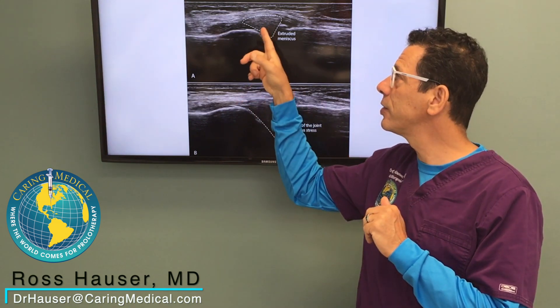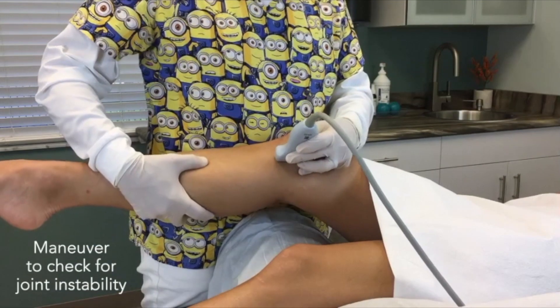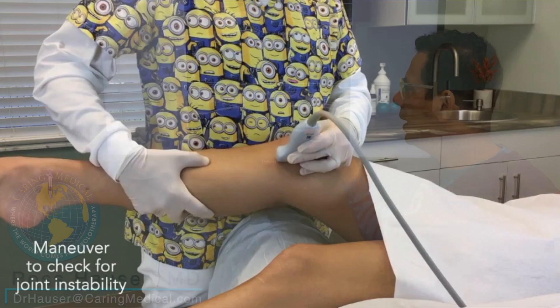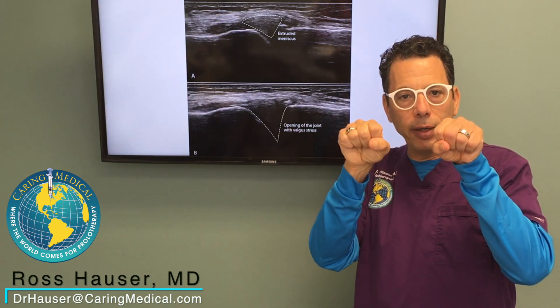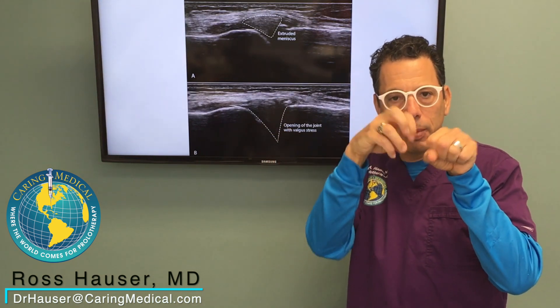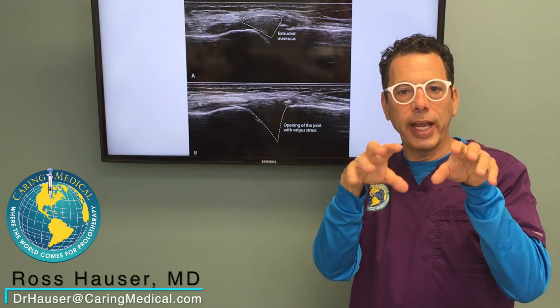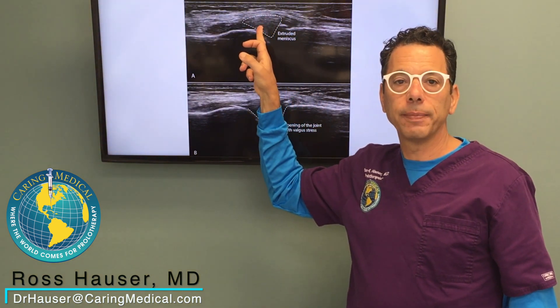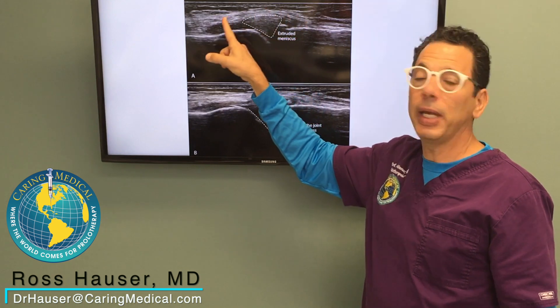We can see this with ultrasound, and then when we stress the knee on physical exam — we just try to pull the two bones apart — what you find is the meniscus then goes back into the joint. The joint pulls apart, so the meniscus goes back in. However, when you take off the pressure, the meniscus then goes back outside of the joint.